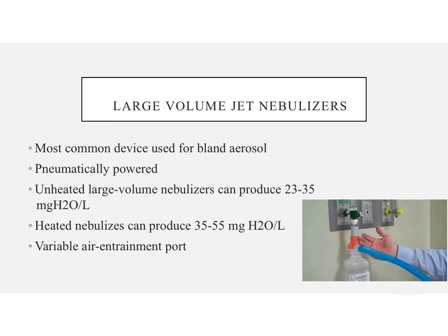So why do heated generators produce more milligrams of water per liter of gas? It's not that they generate more particles, but instead they're increasing the vapor capacity of the gas. So the gas is able to carry more humidity when it is heated.